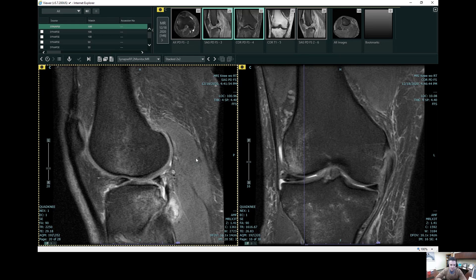No radiation involved, and unbelievable what we can see. So let me show you some of those findings. This is a sagittal series, so we're looking from the side of the patient. This is the front of the patient's knee, the anterior aspect.